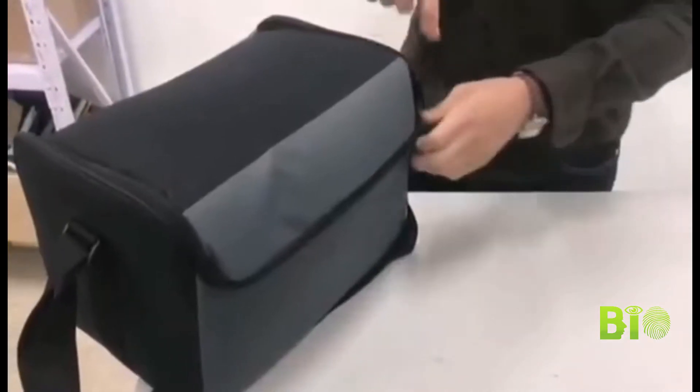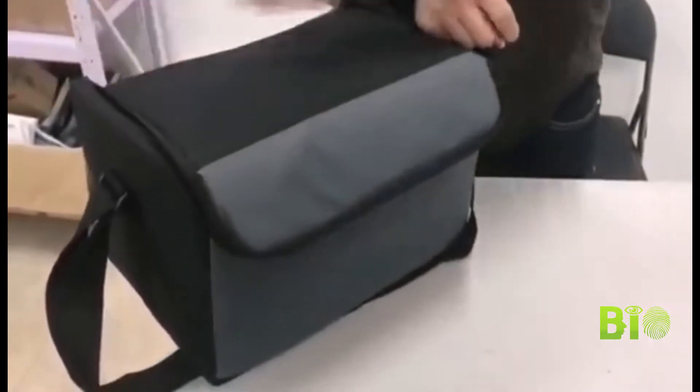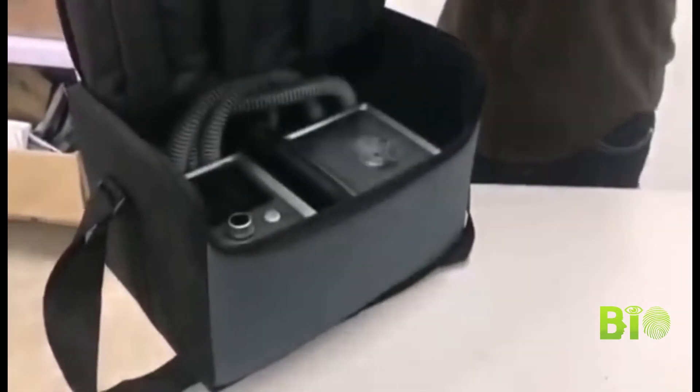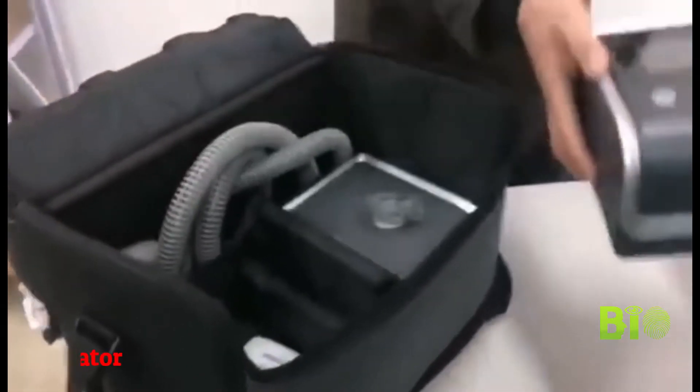Hi there. This is our RISMAR G2 bi-level device. The model is Y30T. It's a sample device, it's not a brand new device — just using it to give you a short introduction.